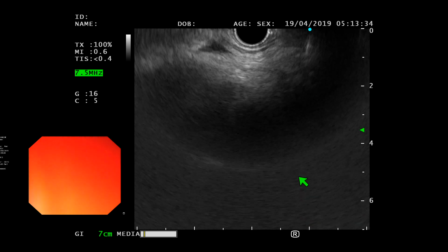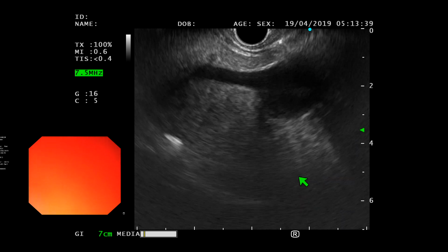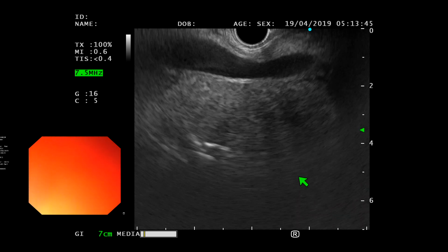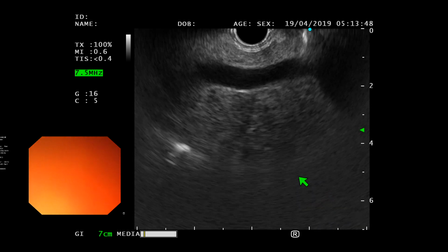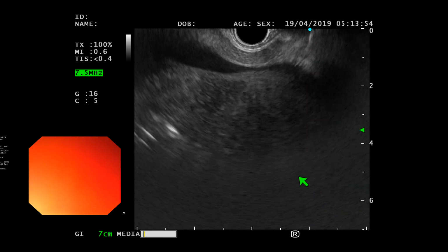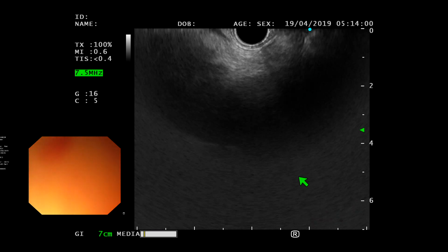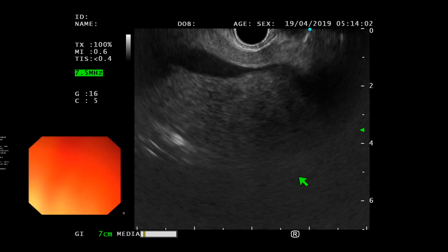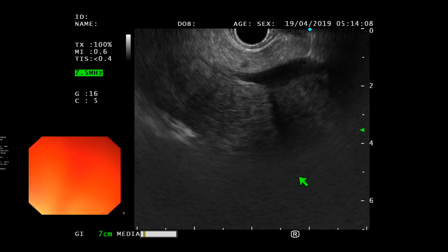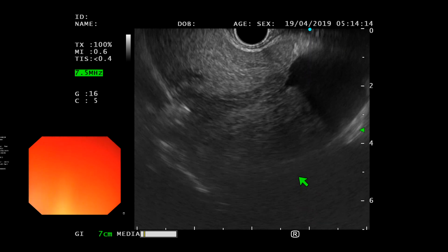So as I said, once the trainee has gone through the steps, it's not just that he knows them, it's whether he can actually link that information to his hand. So information from the brain is what he knows about it, this is the cognitive knowledge, and can he link that to his hand and return back to the brain. I think the problem that we're having here is the knowledge of the scope is there, but the problem is from the hand coming to the brain, which is a very, very common problem. This is the first time, by the way, that OM is doing the EUS.